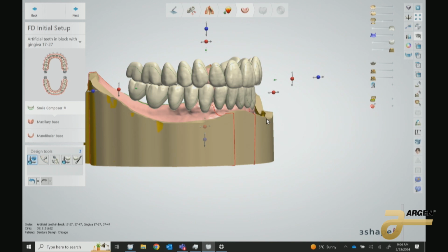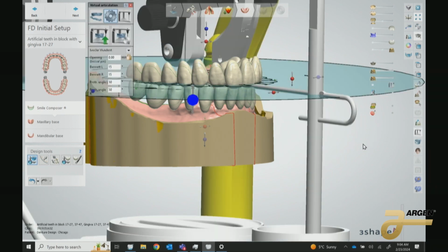So we need to also be teaching our denture patients, if they're biting into something, they might need to bring their lower jaw forward and bite together on their 2 front teeth. Now some people do that naturally anyways, but when they're just biting in centric, they will not have a contact here. And also, when we go into a protrusive movement, so if they're going to bring their jaw forward protrusively and bite down, we don't want the backs of those dentures flipping up and down, right?